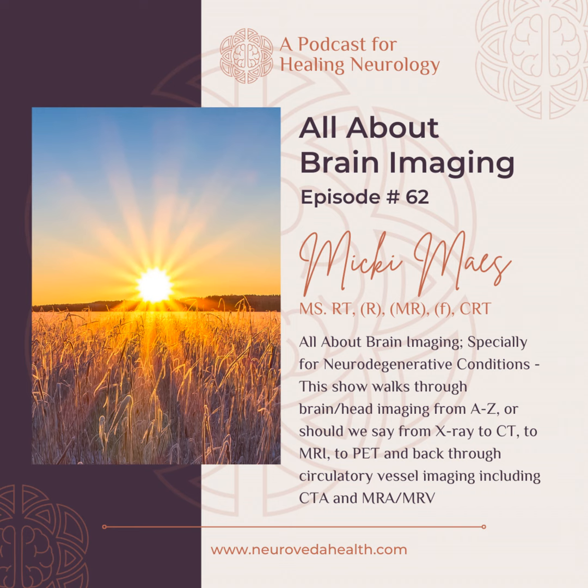But with that, pathologically, we're also going to see amyloid plaques. And that's where PET scan can be useful in looking at the metabolic perfusion, if you will, and associating these amyloid plaques with the radio tracer that we've used. So you can look at synapse loss and really just global neurodegeneration using MRI and PET. That's kind of Alzheimer's.